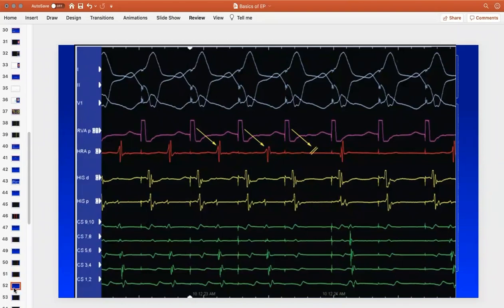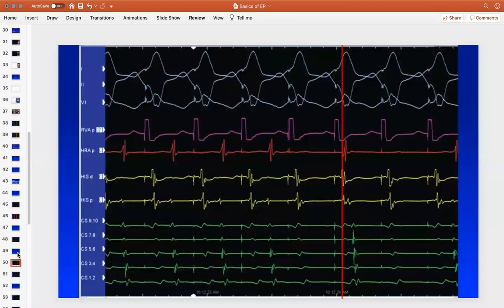Yes. So what's the abnormality here, doctor? Is this a normal response? This is normal. You guys are just breaking the surface, so you don't want to see abnormalities. For you to know, it's just like a simple ECG. This is normal behavior. We see this all the time when we do the pacing. But you have to know what is normal to tell what is abnormal. Because on Wednesday we had a crazy case. We had three consultants scratching our heads just to figure out what was going on. But you have to go back to the basics.